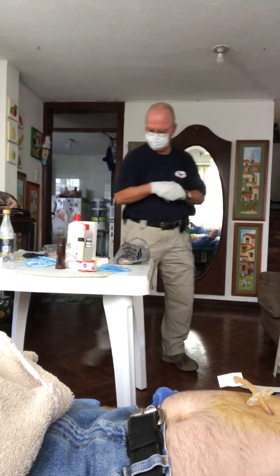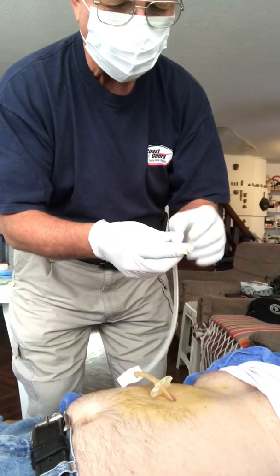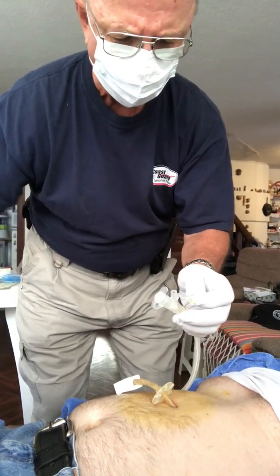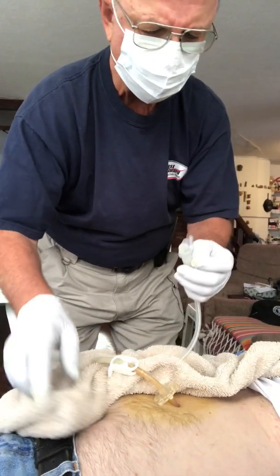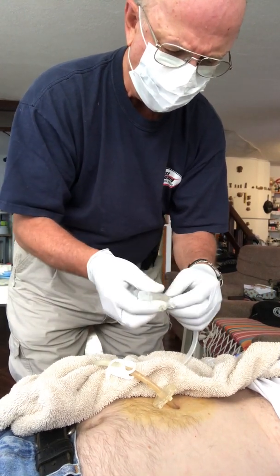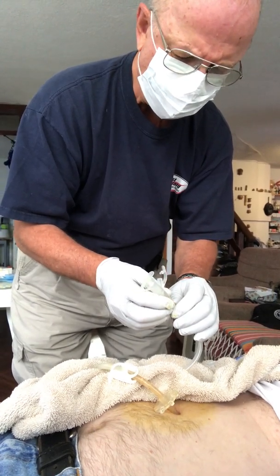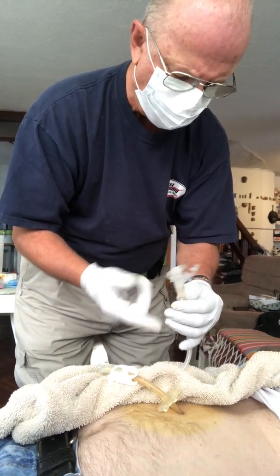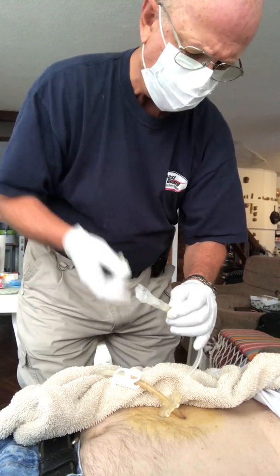Okay, I'm ready. So doctor's in the house. Here's what we're going to do. We're going to take this thing out. Normally, we would put a needle in there and suck the air out of the balloon. But since it doesn't matter, I've got a syringe that fits that thing if you want it. Actually, you're not going to use this anymore. So I'm going to take this out and let the air come out through here, which is the same thing as sucking it out.